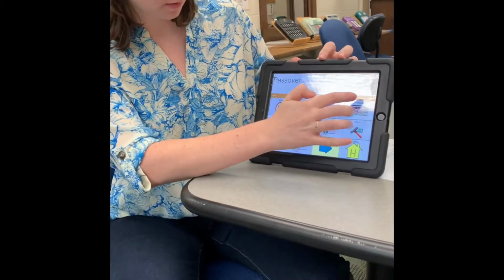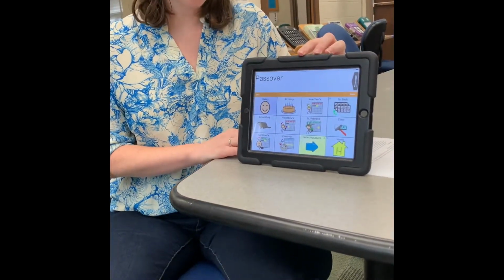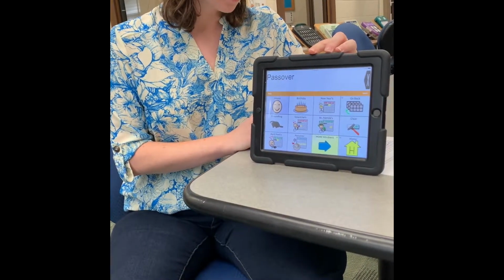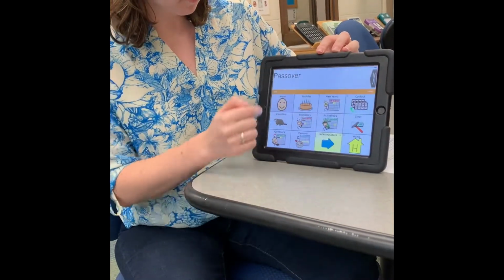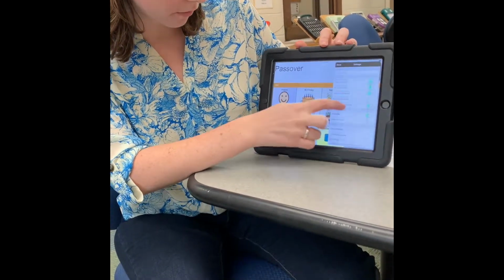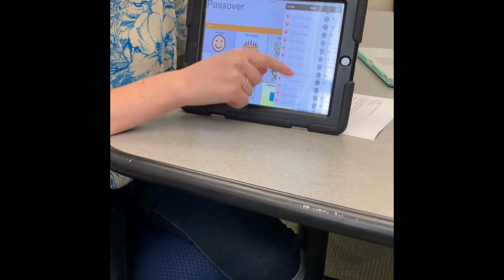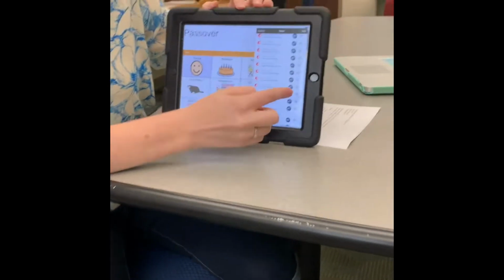Swipe down. The application is designed for individuals who have difficulty using their natural voice. Because of this, users have the option to choose their own voice from a variety of options online. Some voices are only available at a price. To select a voice, go to Menu, Settings, scroll down to Speech, and tap the Voice button, and you can select a list of voices that come with the device and the software to choose one that you think is most appropriate for your own.